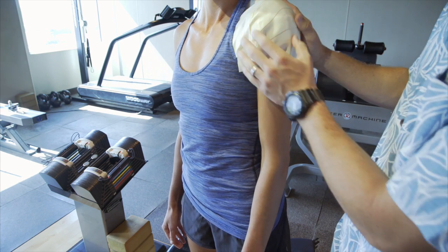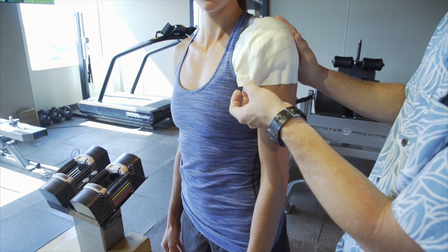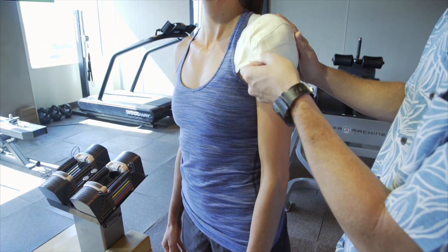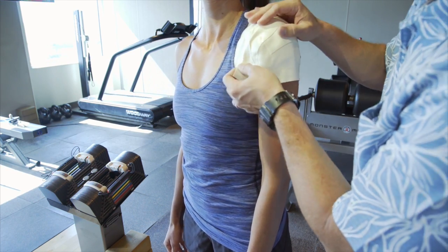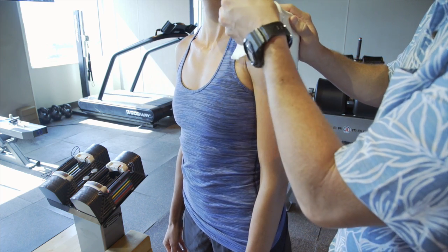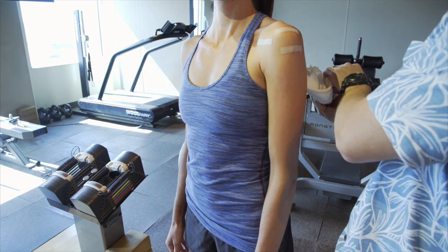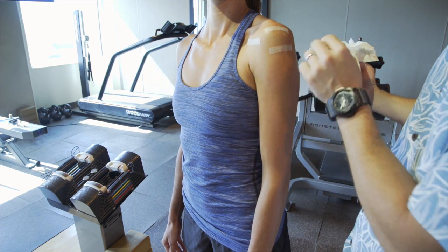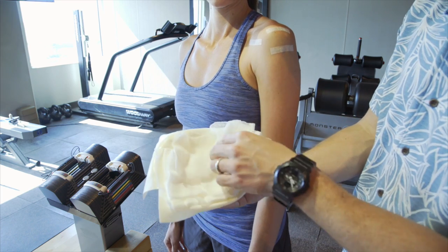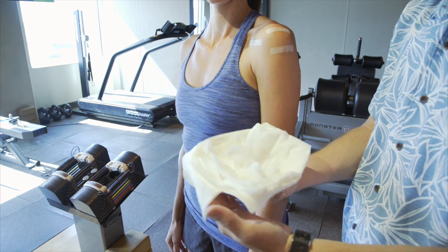At this point you're going to have your post-operative dressing. It looks like a big baby diaper with foam tape on it, but it's pretty simple to take off. Find a loose end and slowly peel it off — sometimes this tape is a little uncomfortable, so go nice and slow. Take it all the way off all the way around and it should come off in one big piece, leaving just the Steri-strips, which are over the areas where I make my incisions for the camera. On the inside of the dressing you'll have gauze and thick absorbent pads that absorb a lot of the fluid that comes out of the shoulder.